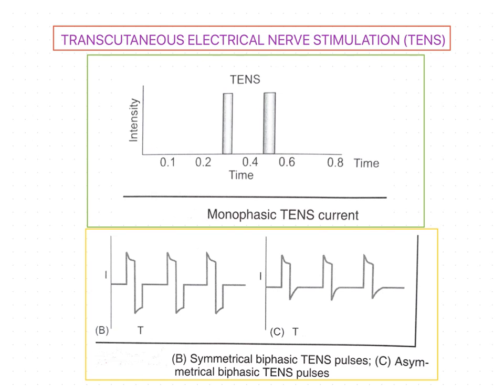Dear students, welcome back. In this session, we are going to discuss TENS, that is transcutaneous electrical nerve stimulation. It is a simple, non-invasive analgesic technique used extensively by physiotherapists in clinical settings to reduce pain of any origin. And the current is often generated by small battery operated machines in which circuits modify the battery's output in such a way that it will have a stimulatory effect.